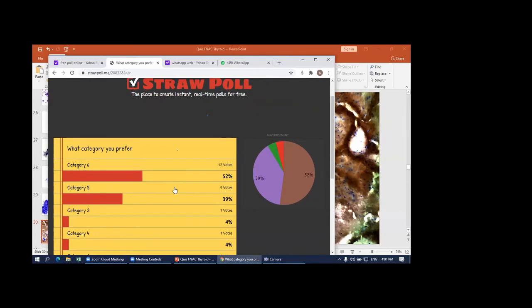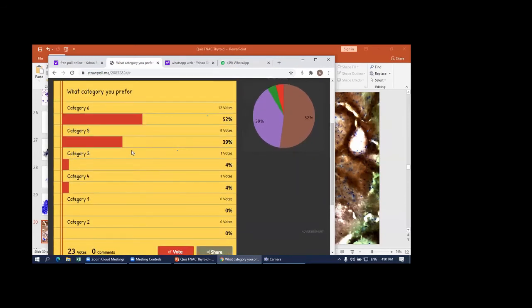Okay, majority of you say category 6. Some of you say category 5. These two are actually agreeable. Cellularity-wise, even though it is quite cellular in the PEP, because the architecture is not that prominent, that's the reason why I put it as category 5. But well, we cannot really disregard the cytologic features of the cell lah, kan.